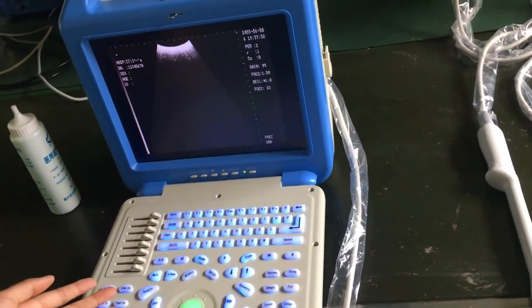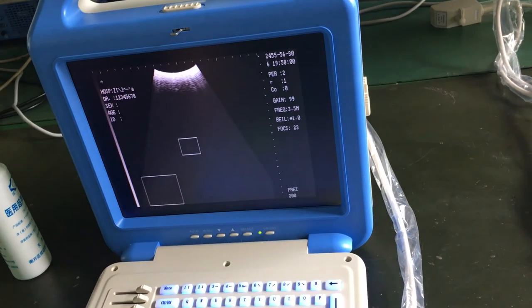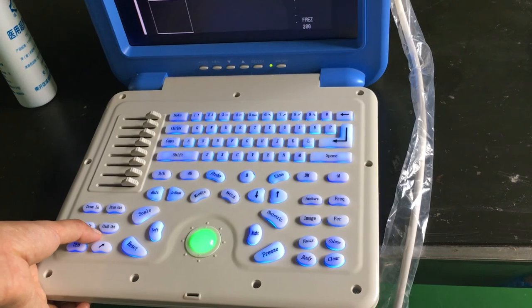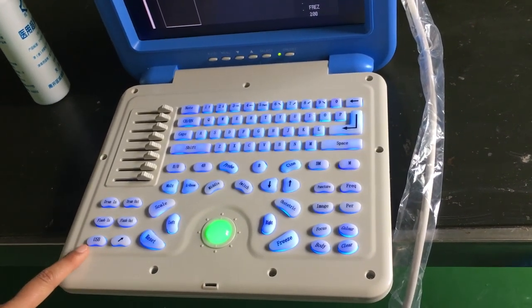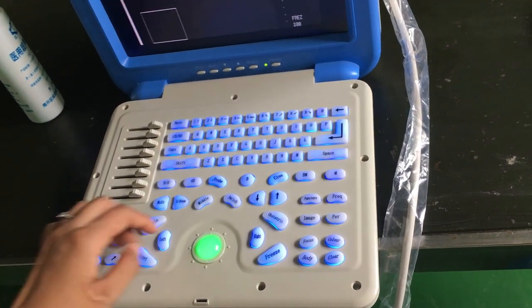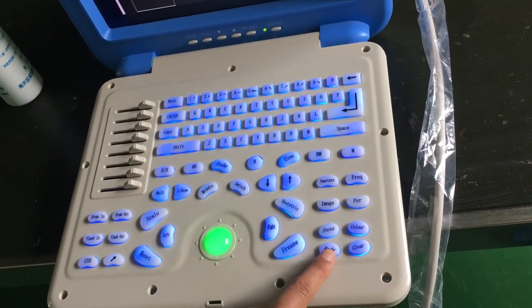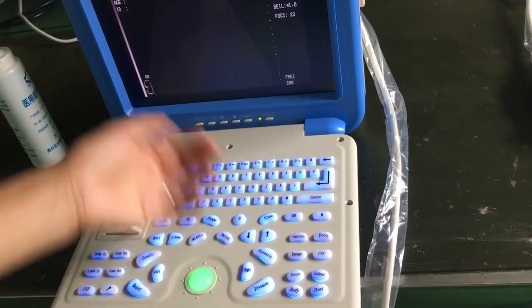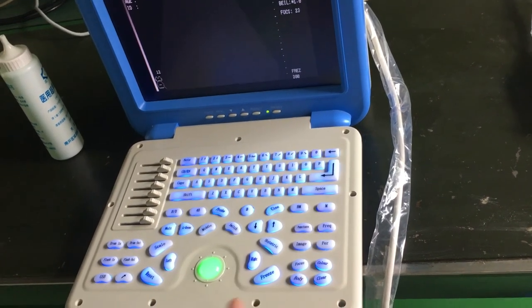Our machine has many different functions. There is a zoom function to zoom in on part of the image, and zoom in/zoom out. There is also a USB function to save images or reports, and a body mark function. You can see the body marks are different and you can choose according to your requirements.